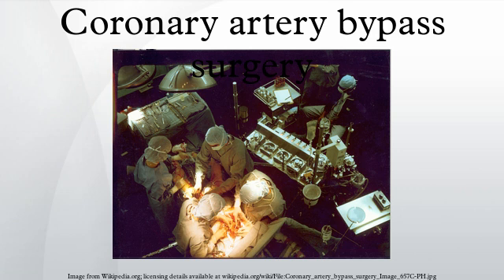In the case of off-pump surgery, the surgeon places devices to stabilize the heart. If the case is on pump, the surgeon sutures cannulae into the heart and instructs the perfusionist to start cardiopulmonary bypass. Once CPB is established, the surgeon places the aortic cross-clamp across the aorta and instructs the perfusionist to deliver cardioplegia to stop the heart and slow its metabolism. Usually the patient's machine-circulated blood is cooled to around 84 degrees Fahrenheit.